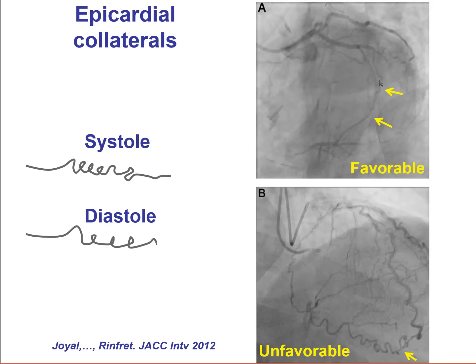Here is an example of a favorable epicardial collateral — large caliber and minimal tortuosity. On the bottom picture is the image of a very tortuous collateral that is unfavorable for a retrograde approach. This is what happens during systole, where the collateral gets compressed, and during diastole, where it opens up. The goal is to allow wire advancement preferentially during diastole, when the tortuosity becomes less.